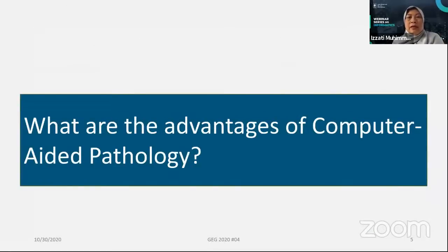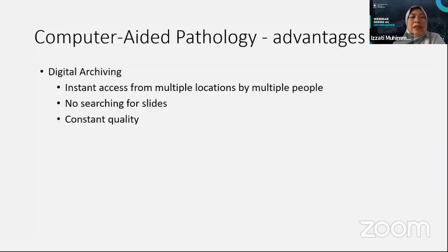Okay. And then what are the advantages of having this computer-aided pathology? As we know, microscopic reading is a very advanced knowledge. It goes back about 100 years ago, when people related the cause of disease to microbes, which can be seen by the microscope.